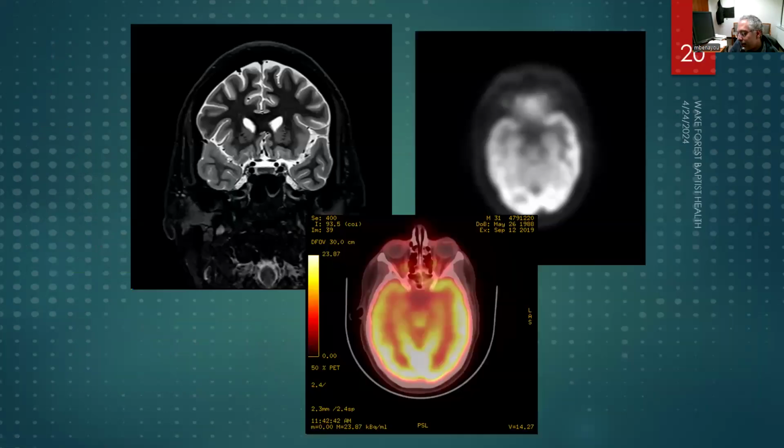And then just because I'm an imager, the following slide and the one after this are just to give you a little bit of a flavor for other imaging that's clinically done in epilepsy, but that is not fMRI, just kind of an adjunct. So this is just a regular MRI here on the coronal. And the finding here is that this white matter on the right temporal lobe is a little bit brighter compared to how dark the white matter is in the left temporal lobe and throughout the brain.